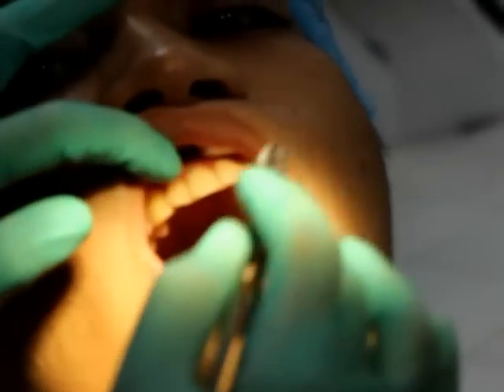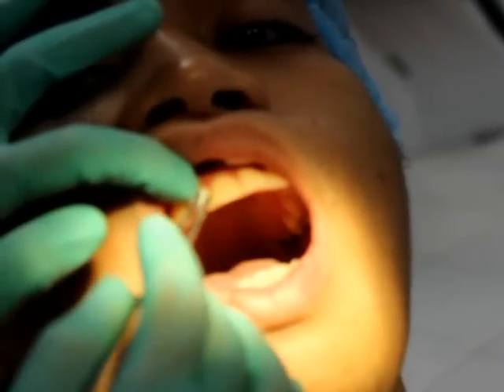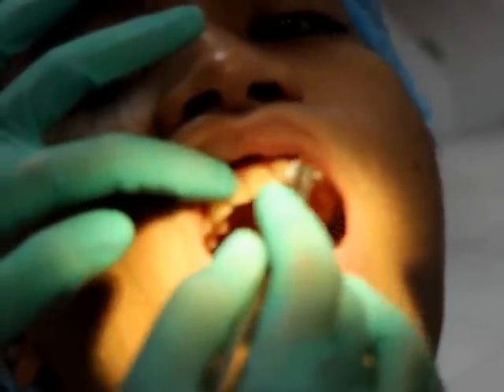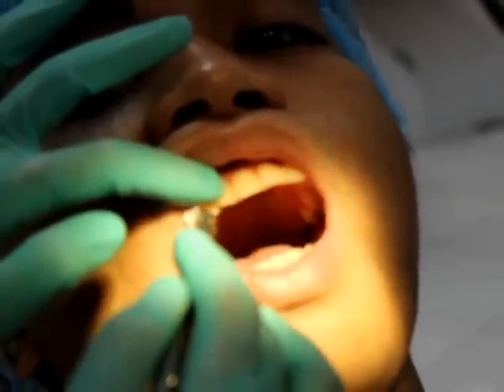Okay. And then, for example, you're asked to do a cold test. If you're asked to do a cold test, and the offending tooth is 1-1, again, you will do it on the contralateral and the adjacent as long as these two are normal. If these are not normal teeth, you have to go to other teeth. Okay? And how do you do it? This is one of the best cold tests.